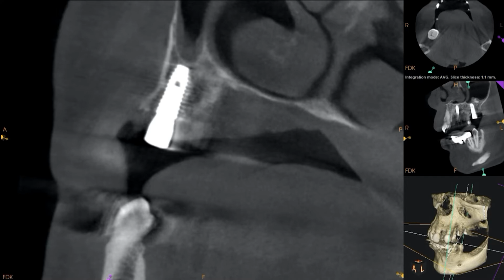If you look at the far right in the sagittal slice, you see even more how nicely intimate the apex of this implant is with the floor of the sinus. So that's intentional. I think a lot of strength is gained from that. That's something I shoot for every time on these posterior maxillary implants. And then with a digital protocol, with the DIOnavi protocol, we can consistently, confidently, comfortably do that without any question or concern.